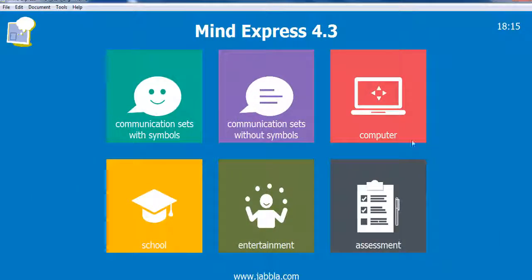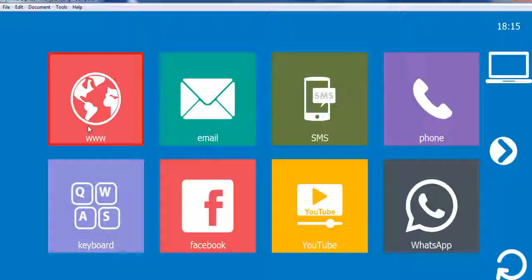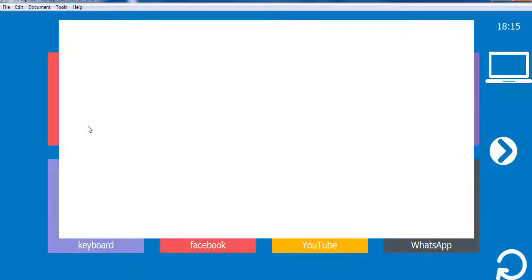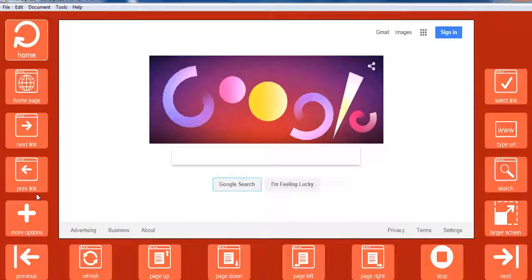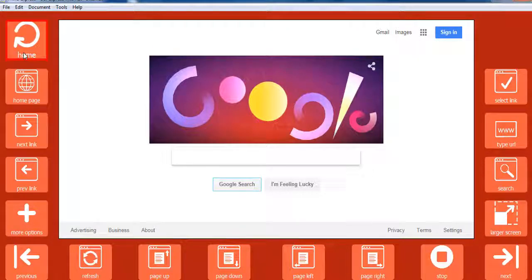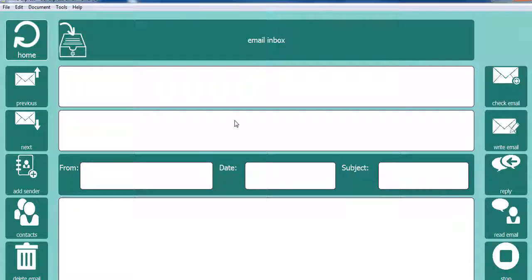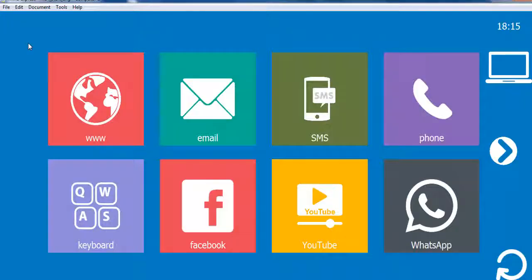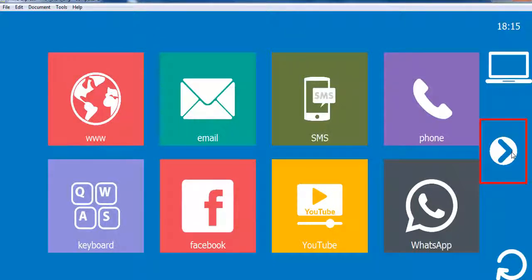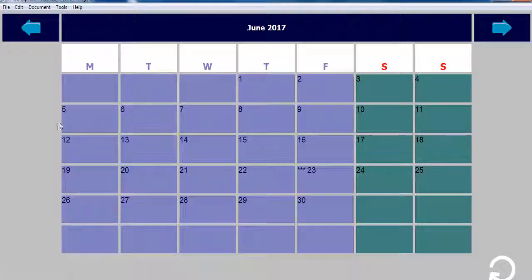The computer section provides access to the internet and supports communication via social media, email, text and phone. There is also a planner to promote independence and develop organizational skills.